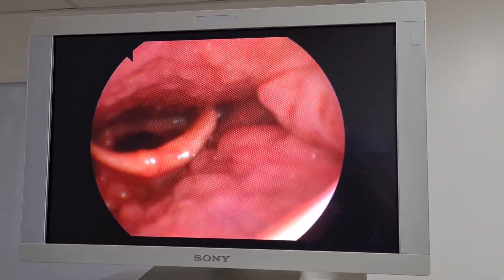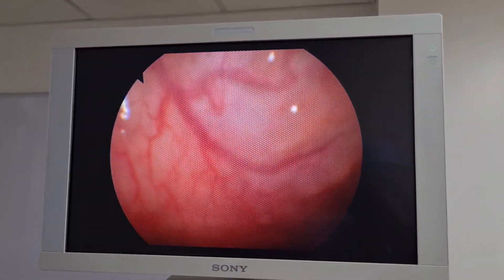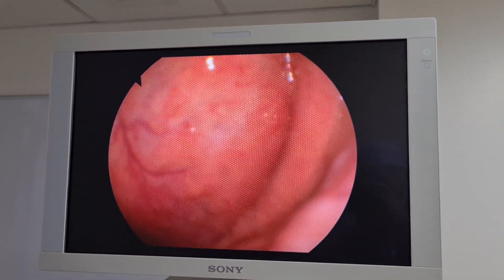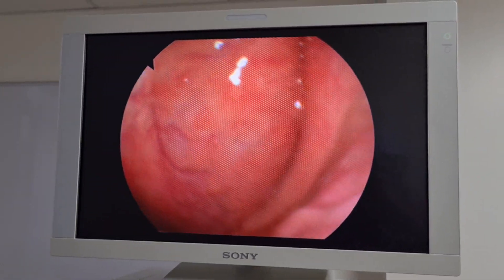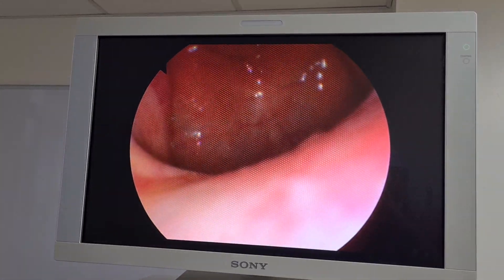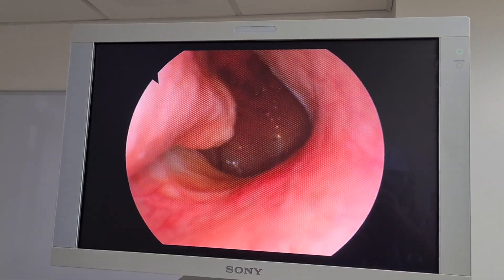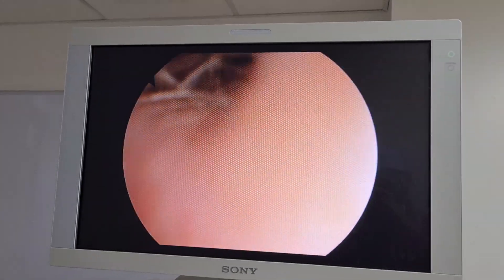Now I'm going to gently withdraw — we have completed this examination. We saw what we wanted to see. We can also turn around and look on the right side, look at the Rosenmüller fossa, and also look at the Eustachian tube. Then we gently come back, and as I withdraw I continue to look at the nose to make sure I'm not damaging anything.